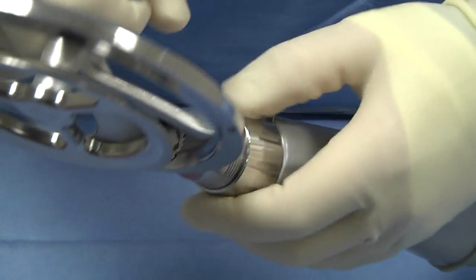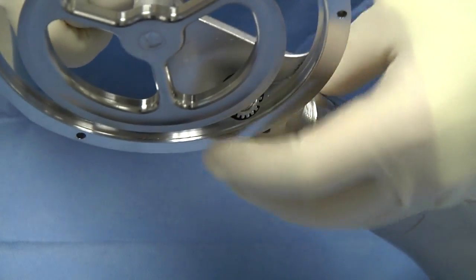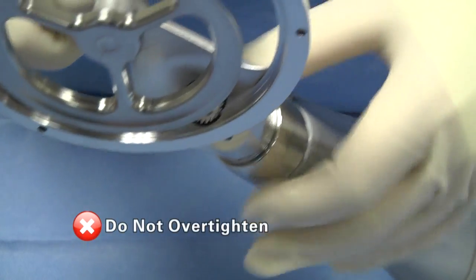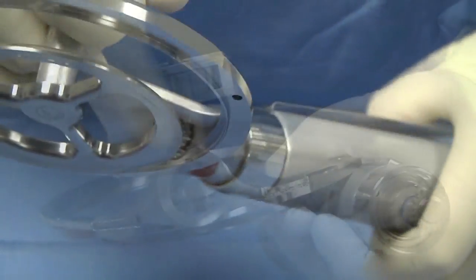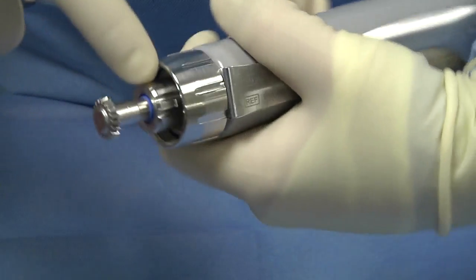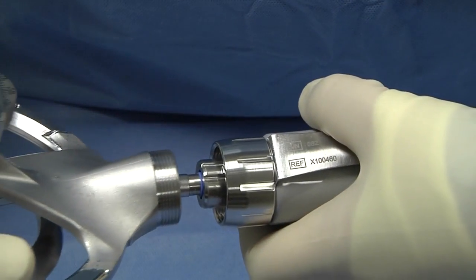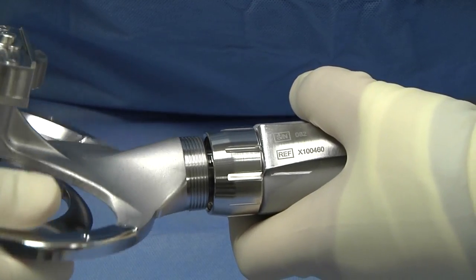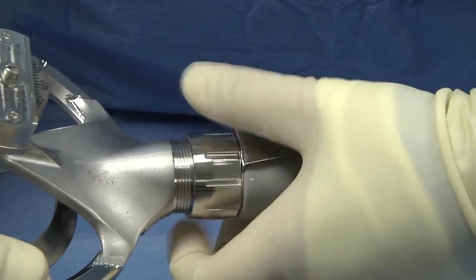Hand-tighten the locking knob clockwise until it stops. Do not over-tighten. Note: be sure the key and slot are aligned and always tighten by turning the locking knob.